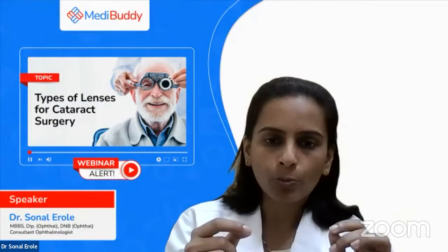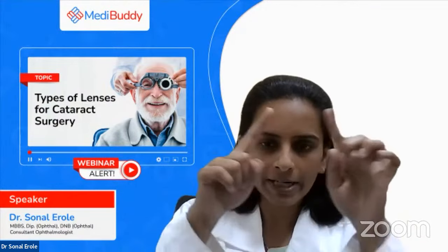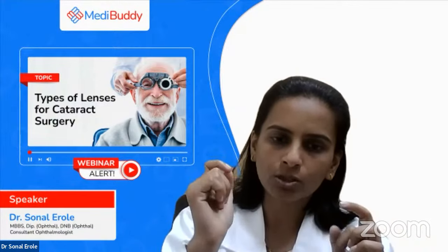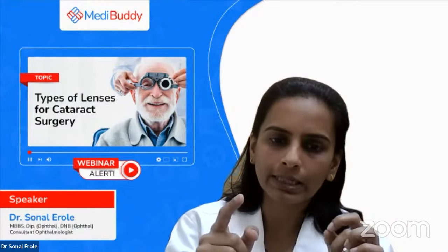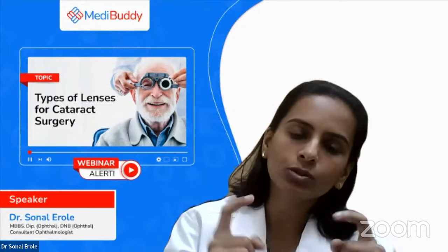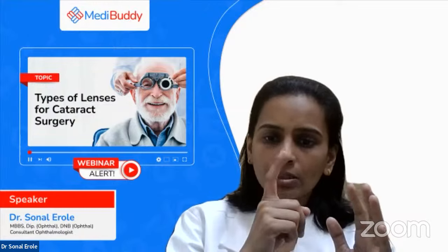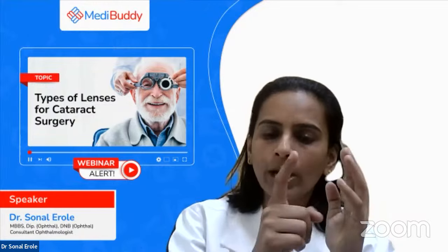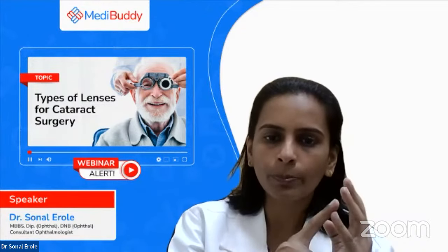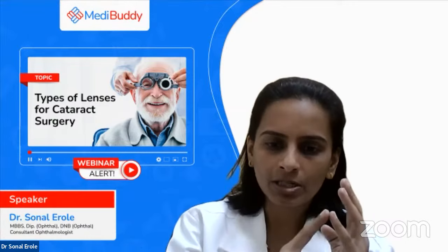Or otherwise, what option do we have? After the cornea, we have a white colored part, which is the sclera. We can anchor these lenses to the sclera also. These lenses are called scleral fixated lenses. We either suture them or just tuck them in over there. So whenever patients do not have good back support, we have options for them also. Nowadays with modern surgery, we are not leaving any patient affected.